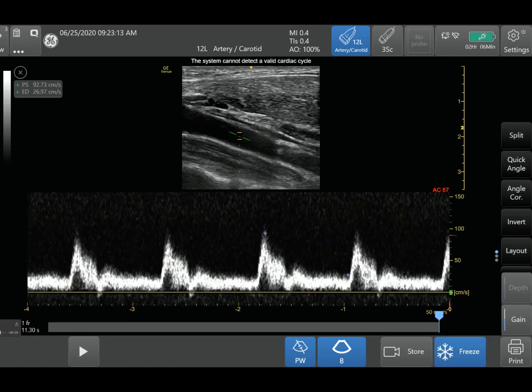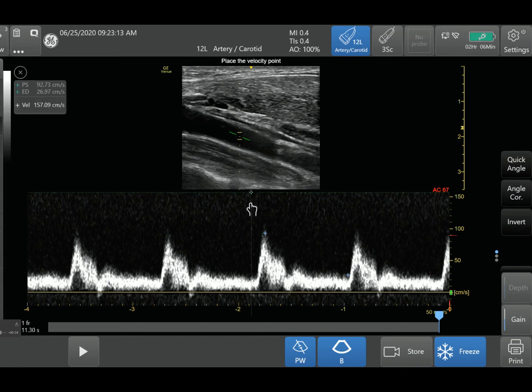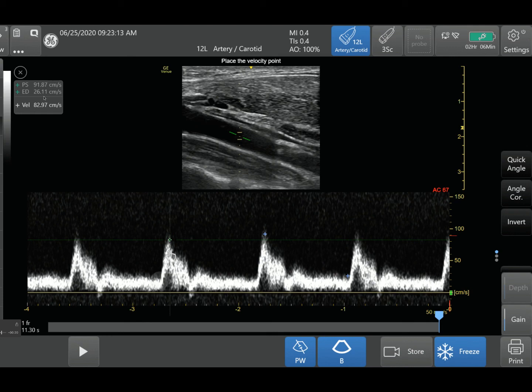Now it's parallel. The waveforms look pretty much the same, but the scale changed. When we take the measurement, you'll see a very big difference — activating the calipers and dragging, it's actually 83 centimeters per second. It more than doubled our velocity just by correcting that angle. Using angle correction is very important and can be very helpful when you don't have the optimal angle of your vessel going towards your probe.